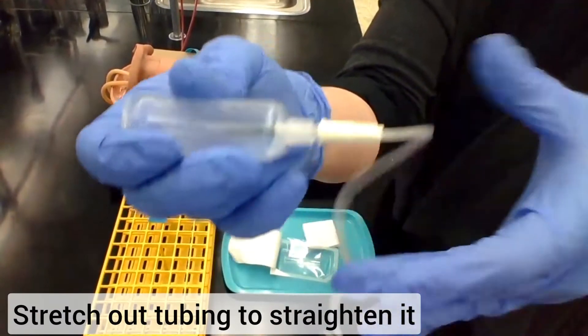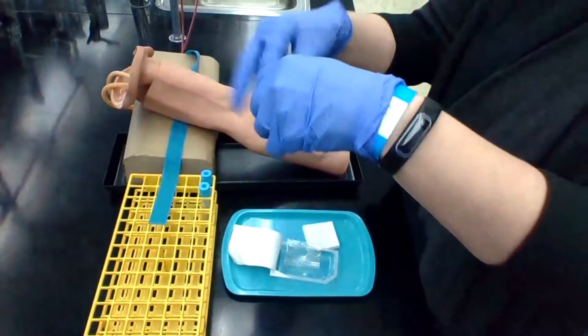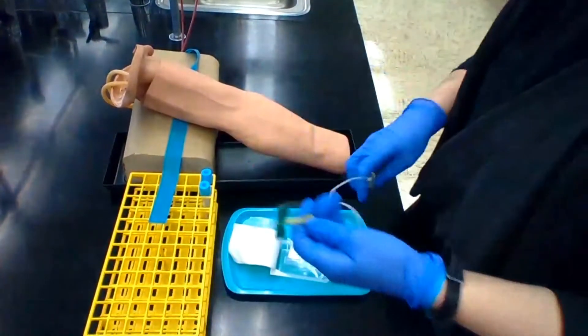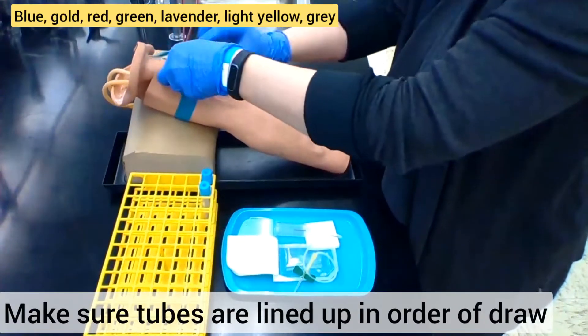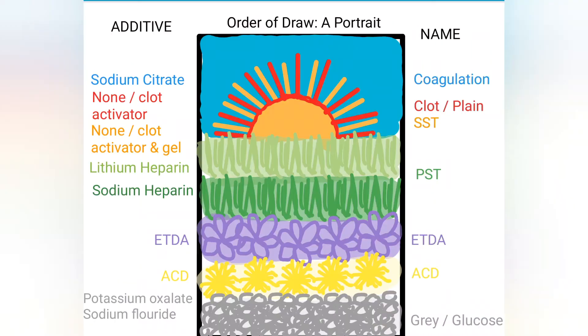Now you want to straighten the tubing. Hold the tube at one end and then use the other to pinch and pull. You can do this before or after you put the holder on. Now that your equipment is assembled, make sure you have your tubes ready in the order of draw. If you need help remembering order of draw, I have a video on a good visual memorization tool for that.